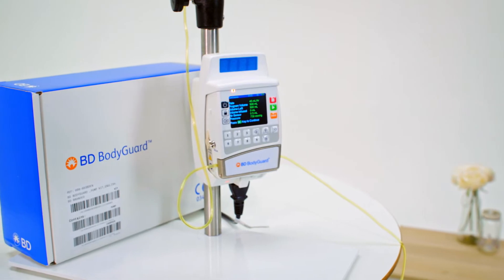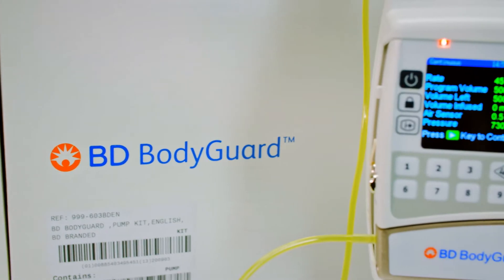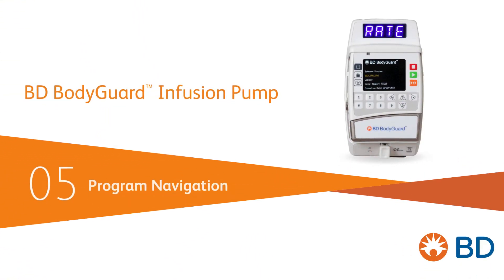Because device use for ambulatory treatment should be simple, the BD Bodyguard infusion pump intends to offer both clear controls for ambulation and ease of use. Our last video provided guidance on priming sets for infusion. In this video, we'll look at how to set up an infusion in continuous mode.